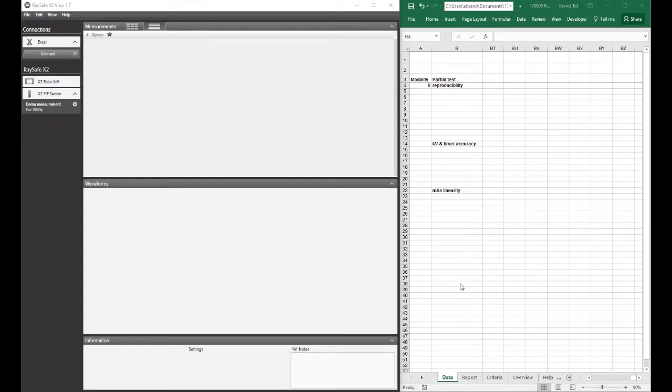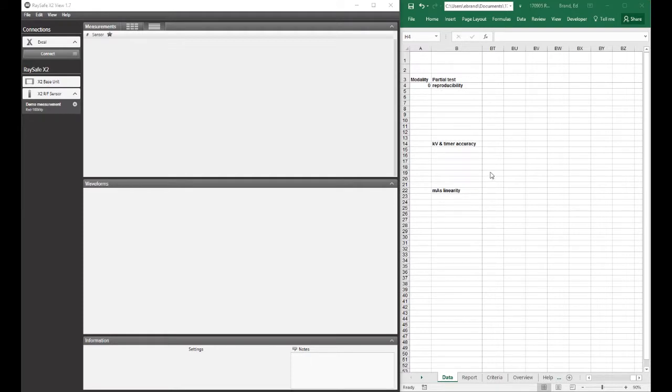Most Excel templates that our customers use have at least two sheets. One is the data sheet, which is used to collect the raw data.